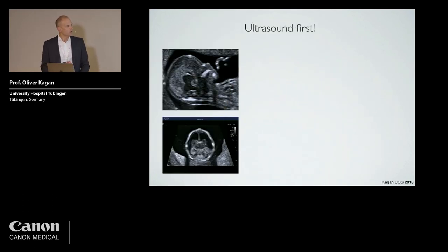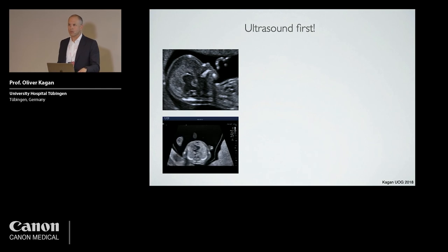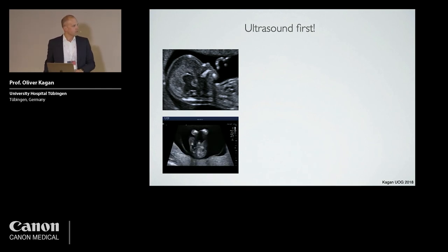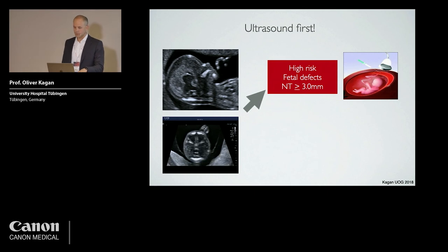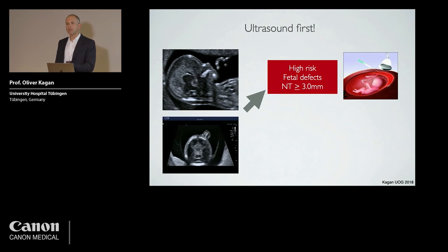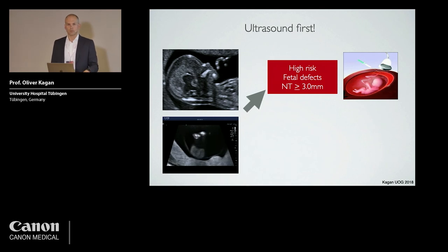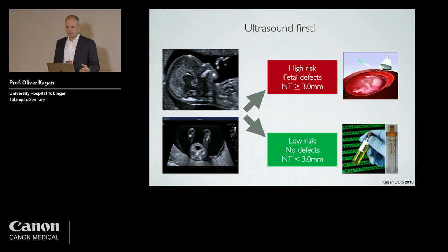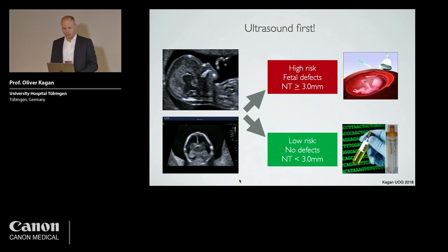Well, I think the most appropriate way of dealing with it is to do an ultrasound examination first. And it's a detailed ultrasound examination that looks for anomalies, and it's not just a CRL measurement. It measures the nuchal translucency, and it's made to identify about half the major problems. And if there is a defect, or if the nuchal translucency is increased to more than 3 millimeters, it doesn't make any sense to carry on with screening. Then it's time for invasive testing, and as we discussed before, it's the question of which genetic test is appropriate. But if the nuchal translucency is completely normal and there are no major defects, then just have a reassurance test, an NIPT for reassurance, and then you can deal with the results much easier.